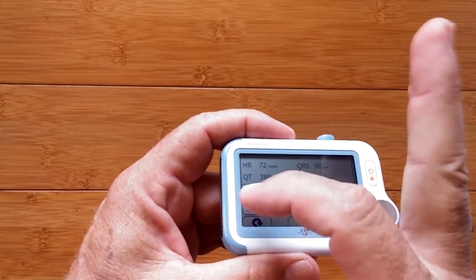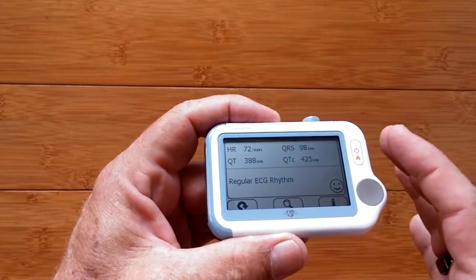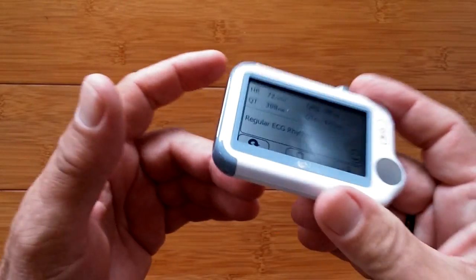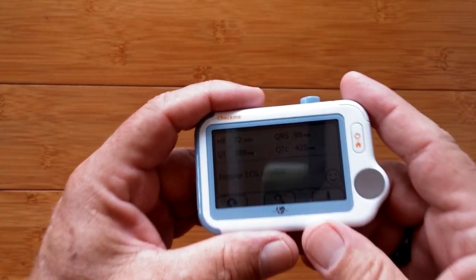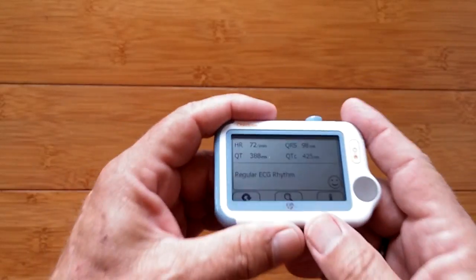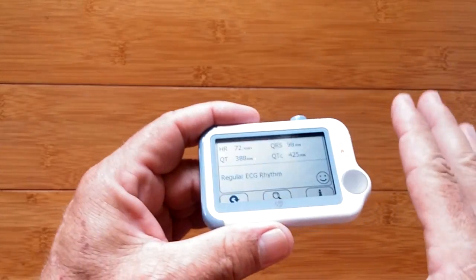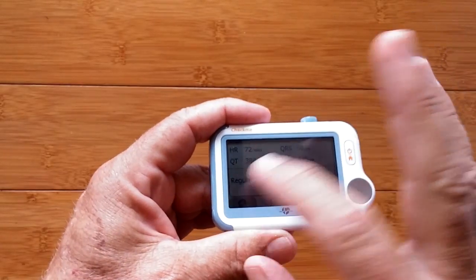The results are very impressive — you get your QRS, QT, and QTC in addition to heart rate. You get a basic overview description of whether the rhythm is regular or irregular, plus all these numbers that are very valuable to a medical professional, including for telemedicine. If you're using your personal device to transmit this kind of data to your doctor during recovery, this is really great.